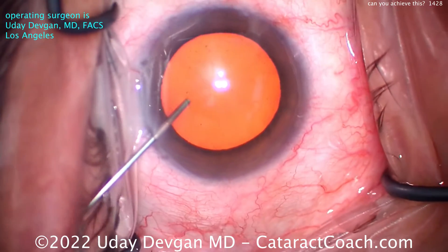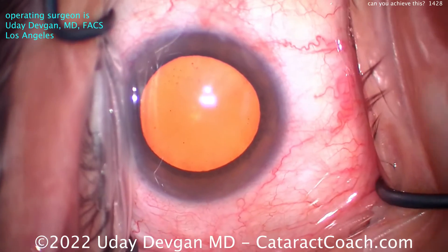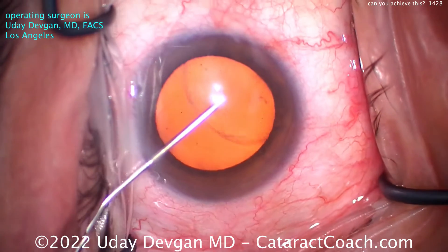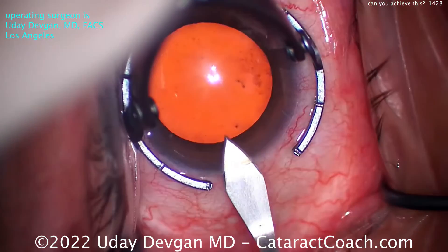Most of the surgeons there were even students in their 20s, and doctors were in their 30s, maybe early 40s. And they were asking, what is it that I can achieve by about case 1,000? And I thought, let me put together a pretty good video of what you can certainly achieve by case 1,000 for a routine cataract case.